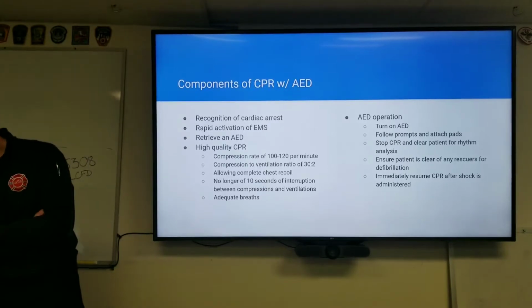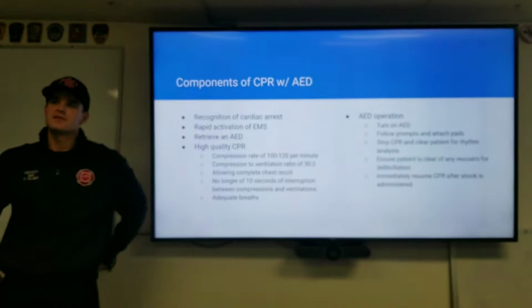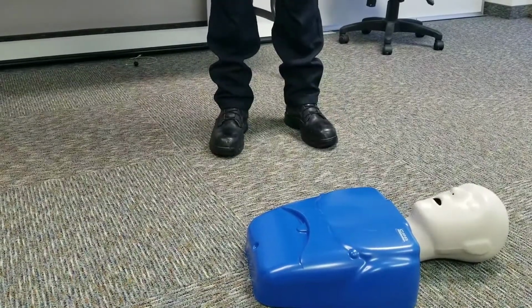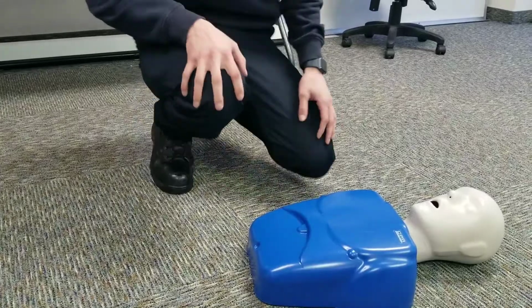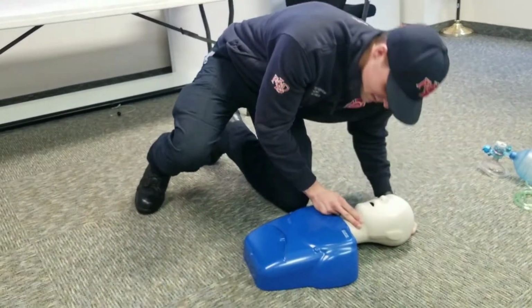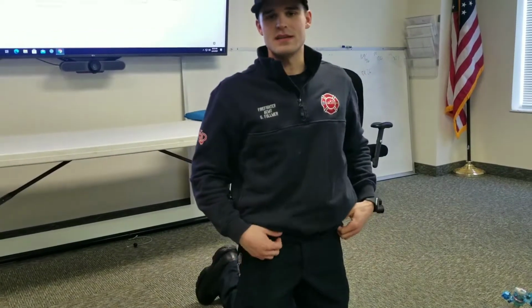So, right now, we're going to go ahead and just do a little demonstration. We'll do a 2-minute full cycle of CPR here real quick on this mannequin. So, find the victim lying on the floor. I'm going to go up to him, see if he has any responsiveness. Sir, can you hear me? Nothing. I'm going to check for pulse and breathing at the same time. Got nothing, so I'm going to have someone activate EMS, call 911, and go grab an AED if possible.